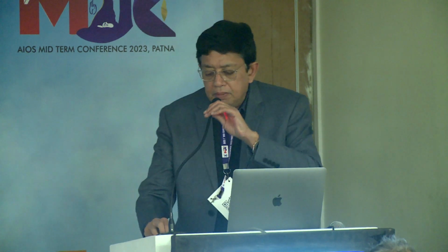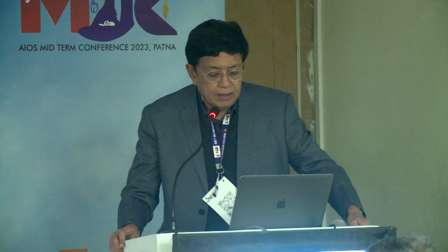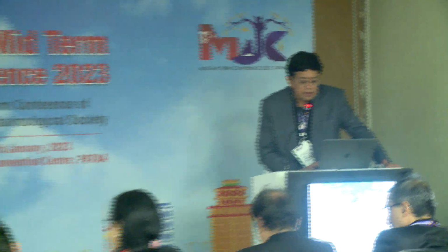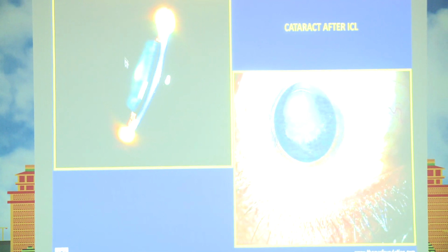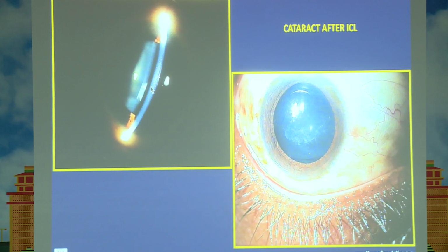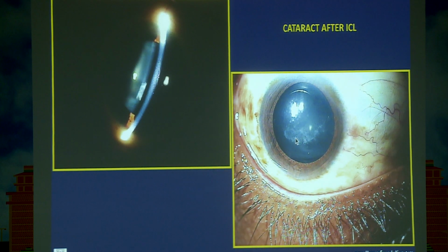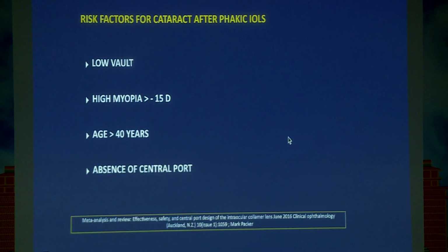Thank you. I'll be speaking on this topic of phaco after phakic intraocular lenses. Most often you come across a situation like this where there's an excellent vault, a very clear lens, a well-centered intraocular lens, a very happy patient. But sometimes you come across situations where there is an anterior subcapsular opacification, and especially if it impinges onto the central visual axis, it starts impairing vision and you need to take care of this.